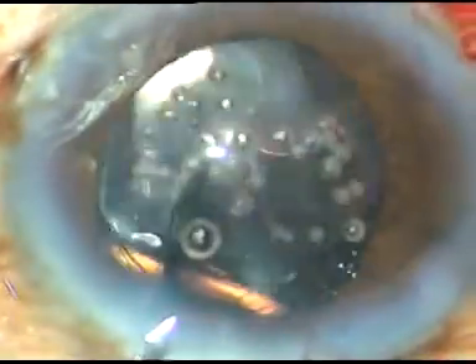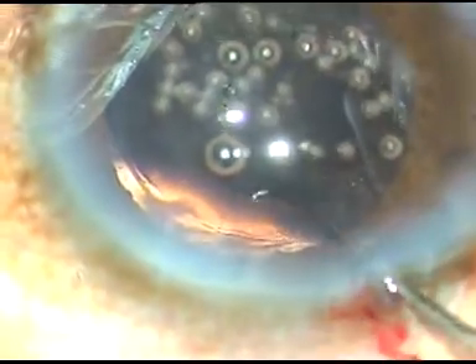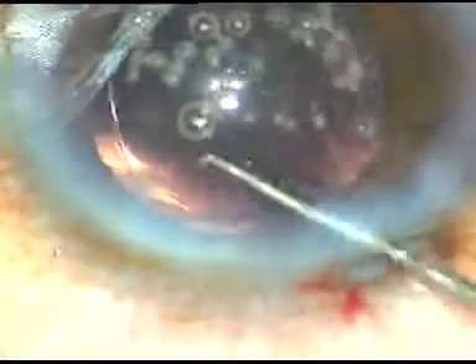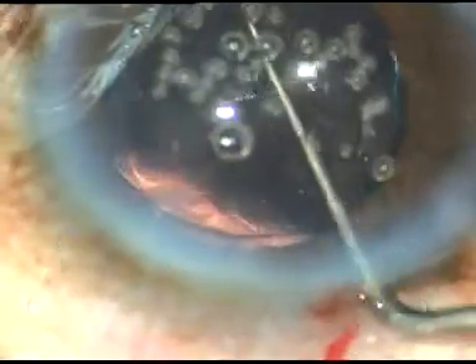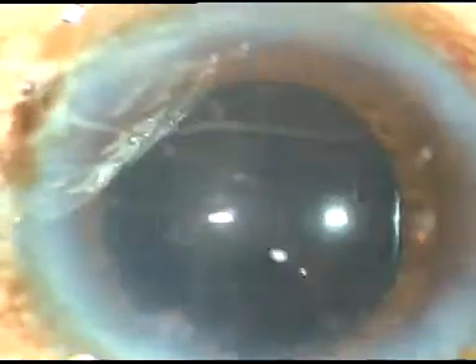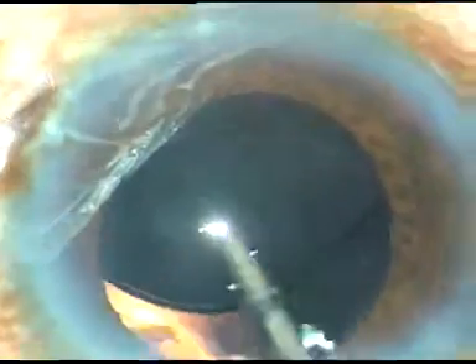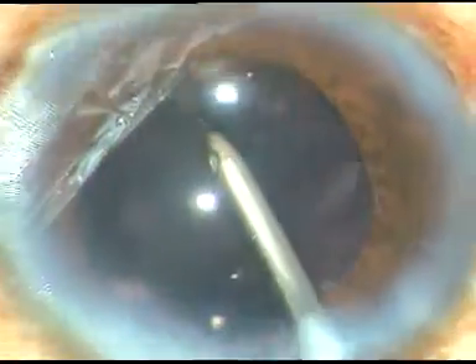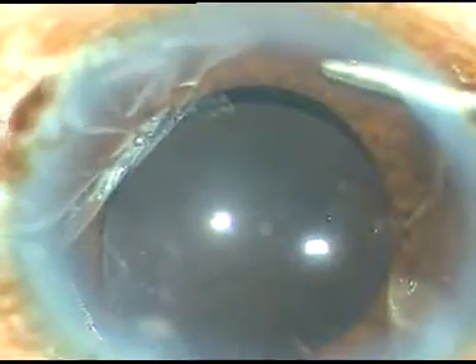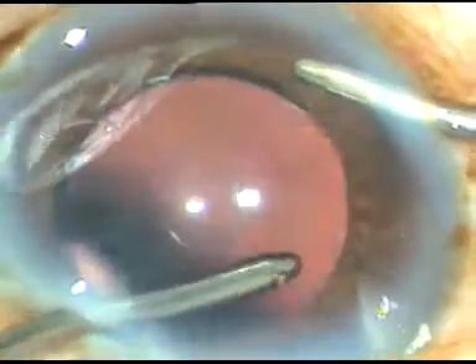After injecting viscoelastic substance, this intraocular lens is implanted in the capsular bag. This is the Akreos lens from Bausch and Lomb — it unfolds very quickly, which is a bit uncomfortable for me, however it can be managed. The lens is in the capsular bag. Some viscoelastic substance has been removed by depressing the posterior leaf. Now the viscoelastic substance is being irrigated out first by the irrigating probe of bimanual IA, and then irrigation and aspiration are used together. At this time I remove the fibers projecting from the anterior capsular rim.